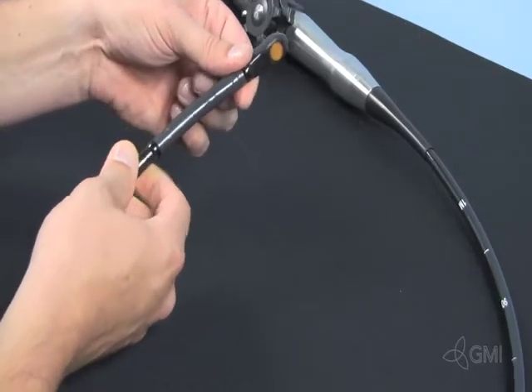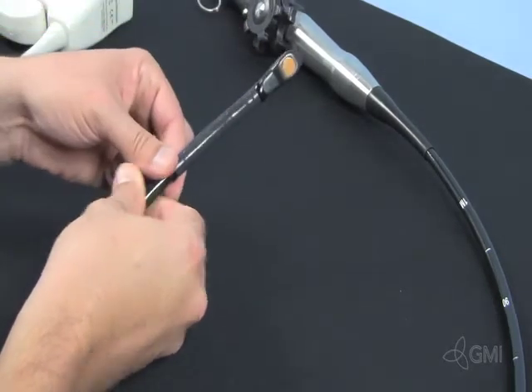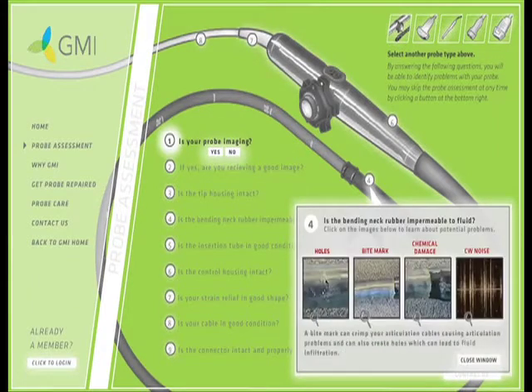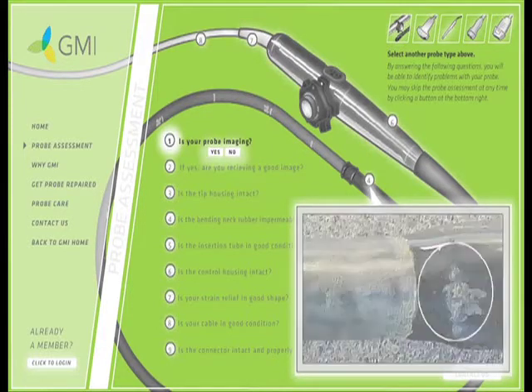Inspect the BNR or bending neck rubber for cuts, nicks, tears, and holes. Also check for bite marks, chemical damage, and separation from the seal beads. When imaging, check the BNR specifically for CW noise.